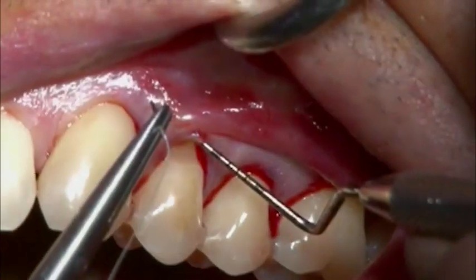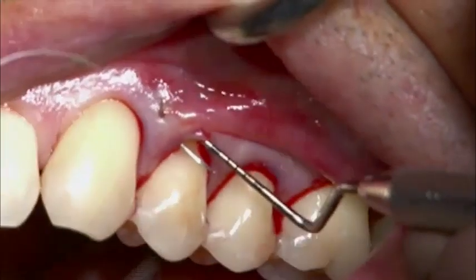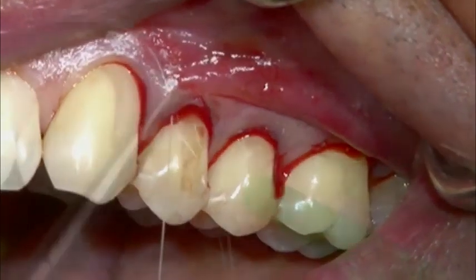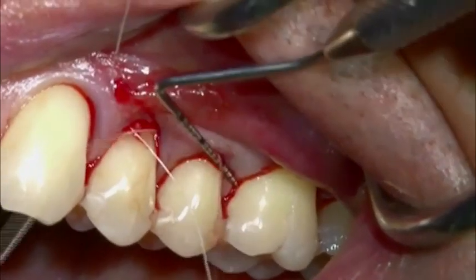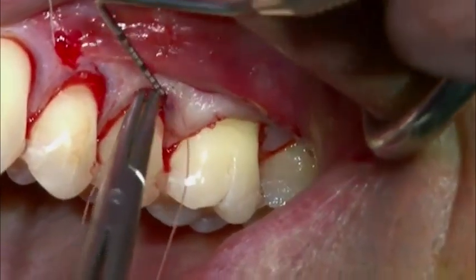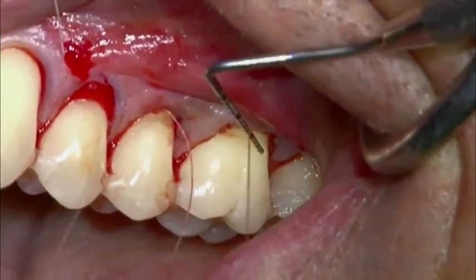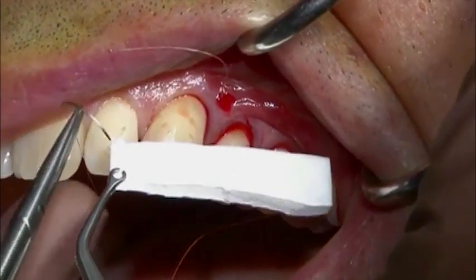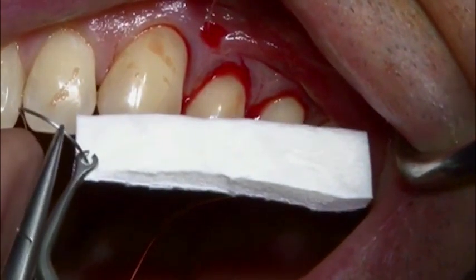A 6-0 Vicryl Ethicon suture is used to introduce Geistlich Mucograft into the tunnel. The needle enters the papillae from the outside to the inside of the tunnelized flap and passes behind each papilla, exiting at the largest recession in tooth 2-6. A vertical mattress suture is introduced into the leading edge of the dry, trimmed Geistlich Mucograft in order to slide it under the tunnel.